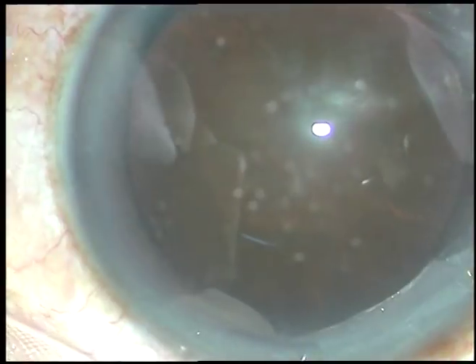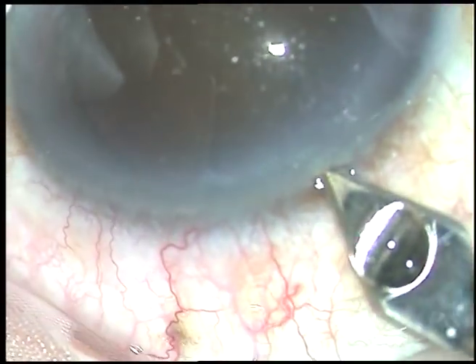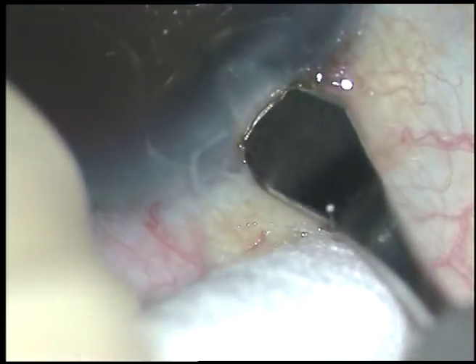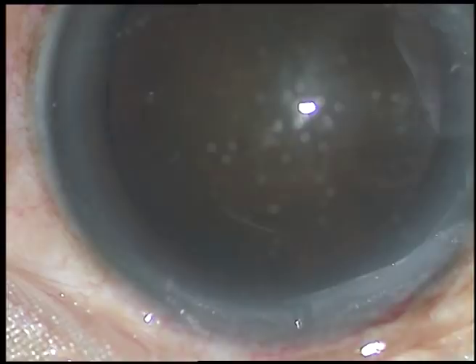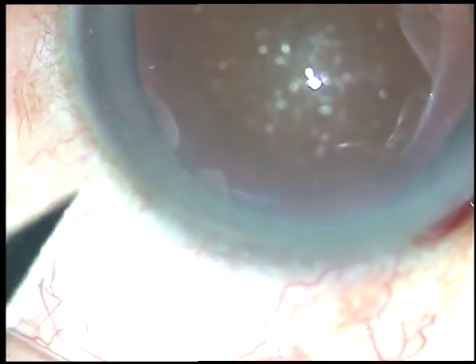And now, make the main incision. This is a 2.8 mm mid-limbal incision. This is a cataract with grade 4 nuclear sclerosis. The main incision has been made.